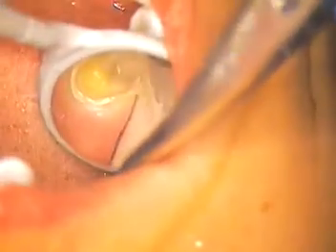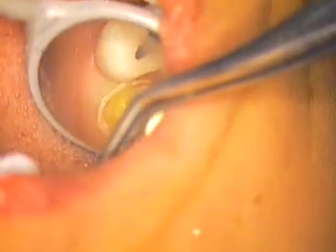Just our bread and butter. Again, we had an old amalgam removed, cleaned up, took the Dycal out underneath. Tooth was preoperatively sensitive. Hopefully, should be very comfortable with this tooth. Now, this is our little chimney. We just cut these out. I want that cut a little smaller. And we'll just put that right in place with a cotton plier. Alright.